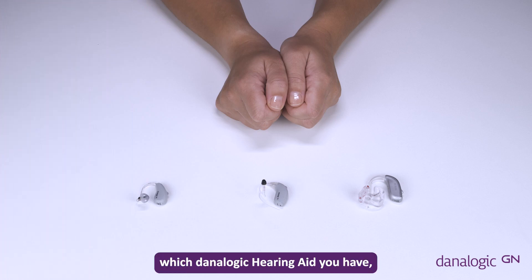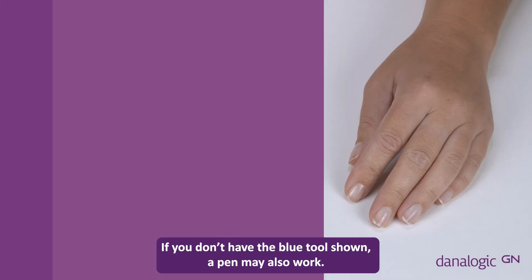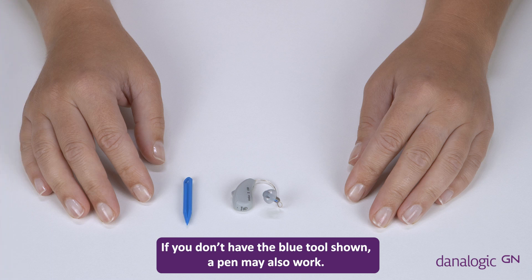If you're not sure which Danalogic hearing aid you have, please see the 'how to identify which Danalogic hearing aid you have been given' video. If you don't have the blue tool shown, a pen may also work.